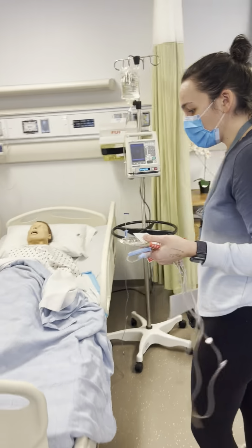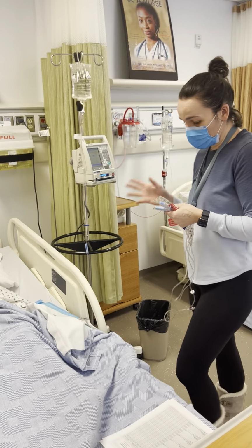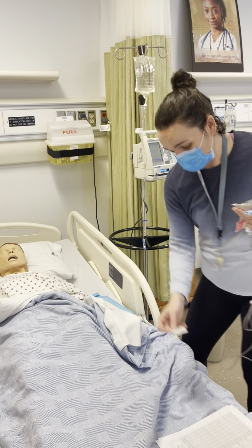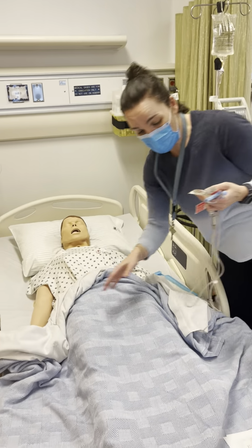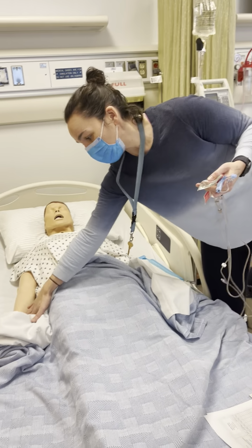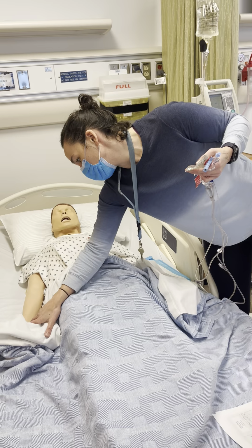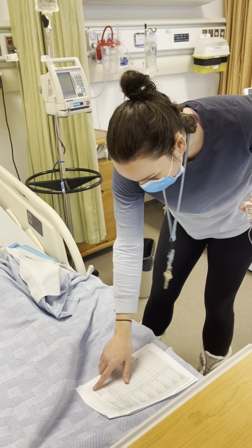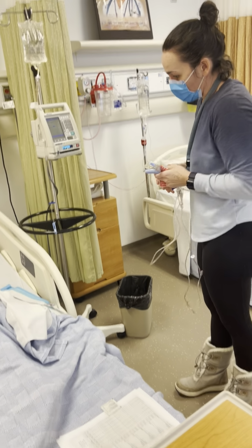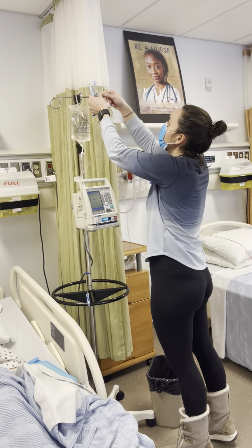So we'll do our hand hygiene, we'll introduce ourselves, we'll get our patient identifiers, ask him to verbalize his name, and we're also going to compare our MAR and our med with the wristband and make sure everything matches up. So everything's Scotland Bryson, 1, 2, 3, 4, 5, 6, 7, 8, 9, and that's all good. So I'll just hang our meds right here for now.